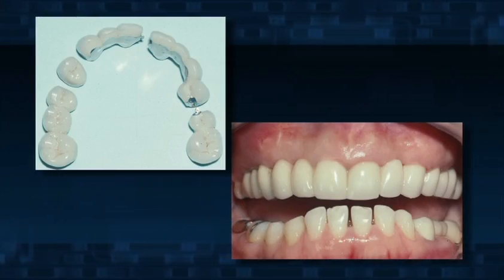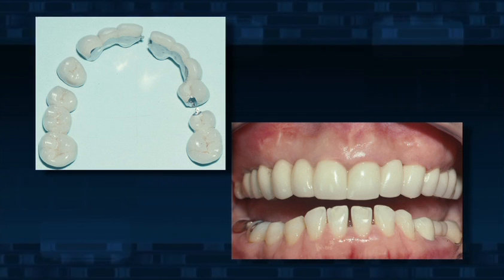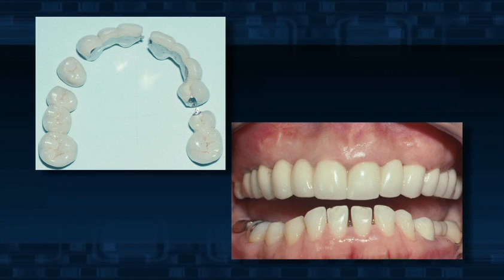Now the bridge has to be cemented into the mouth, and it will then become a part of the patient's body. It cannot be removed by the patient. Well-made fixed bridges are very difficult to detect from natural teeth. The patient feels like it's his or her own teeth.